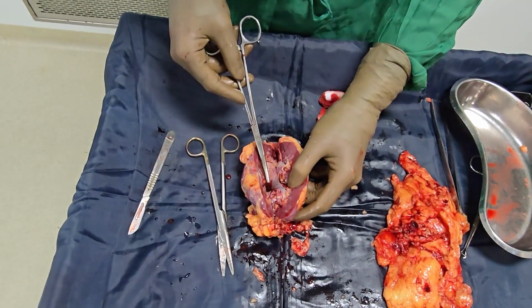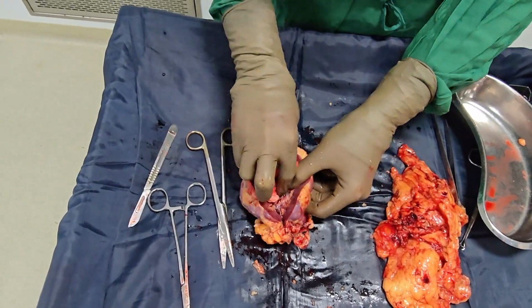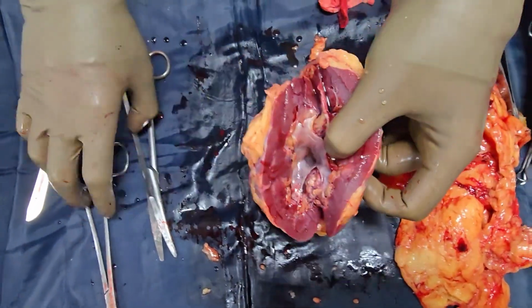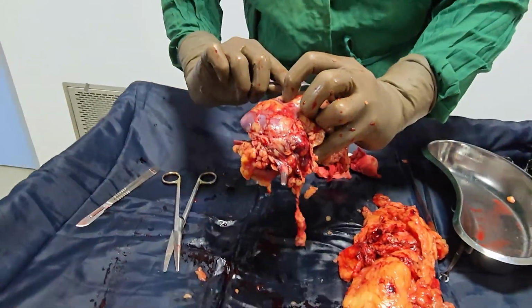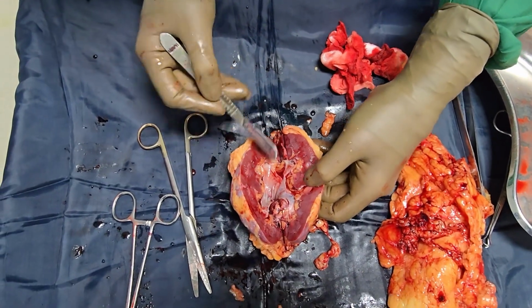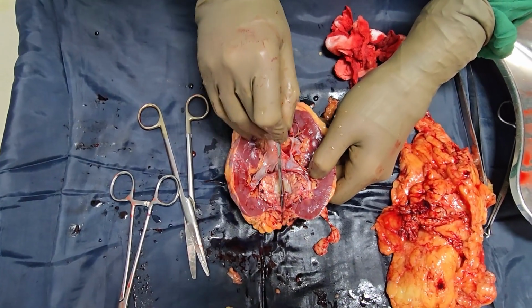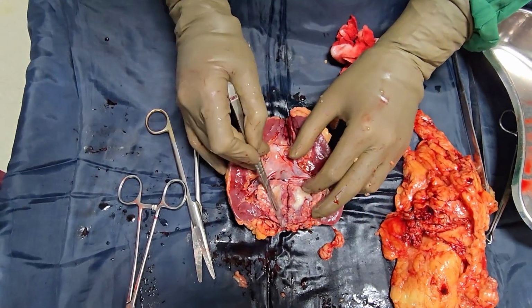These are the calyces, and that's the pelvis, and this is the ureter. Now I want to further cut open the lower pole in such a way that the tumor also gets bivalved. Here the ureter is appearing. Now as I cut open the tumor in its center, see the yellowish appearing tumor with a glistening center.